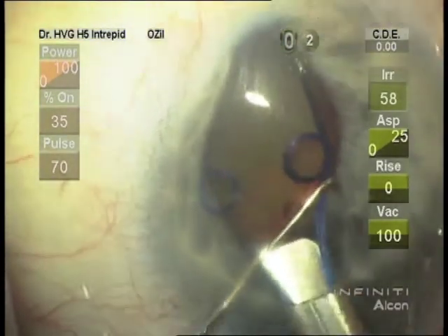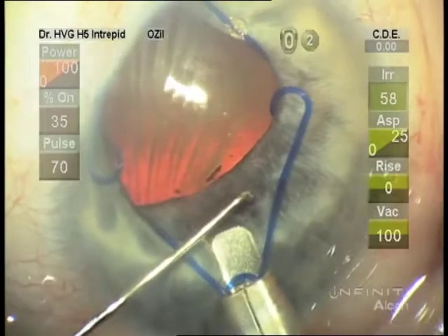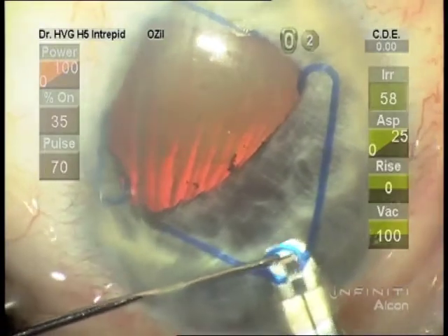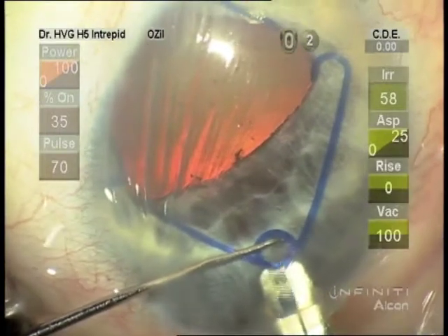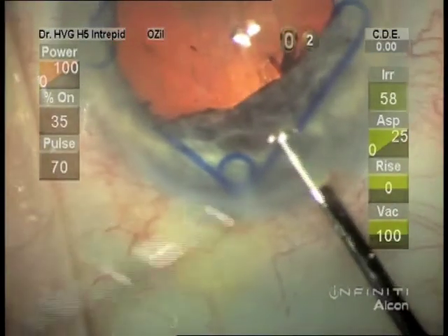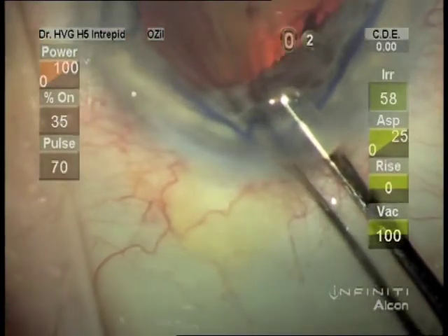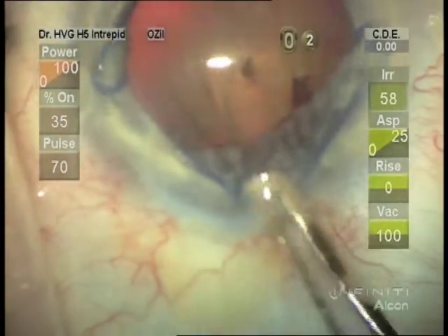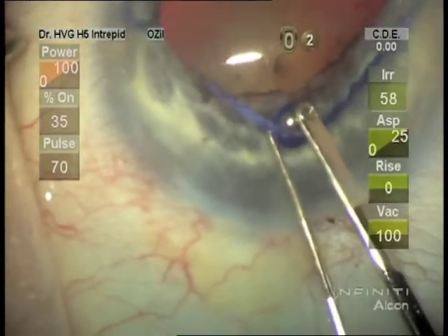We're pushing down a little to make sure it gets under the iris. Now we're using the synechia hook to stretch the pupil and then push the Malyugin ring to engage the sub-incisional pupil.